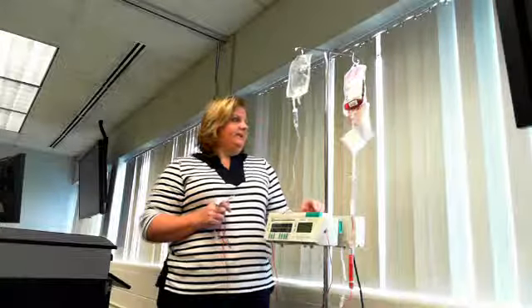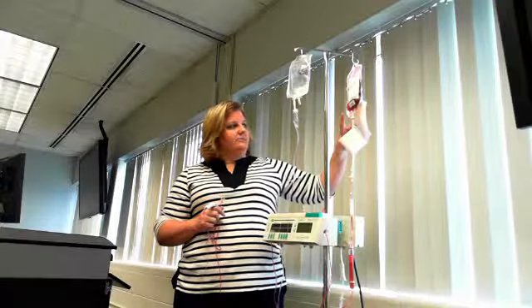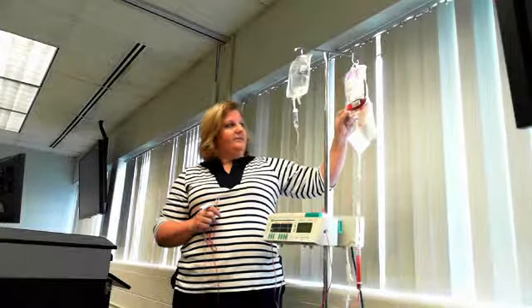Once blood is complete, if they have another unit, you go through the entire same process as the first unit — including the two-nurse check, vital signs, everything is completely the same. You must wait 30 minutes between units of blood. You have four hours to get the blood in, and 30 minutes to start giving it from the time you leave the blood bank.